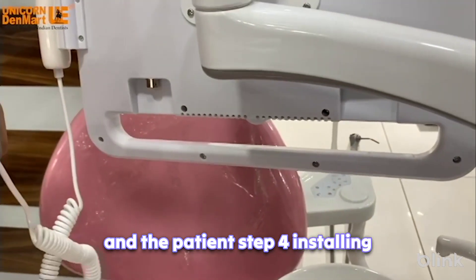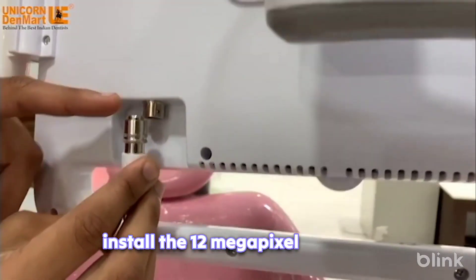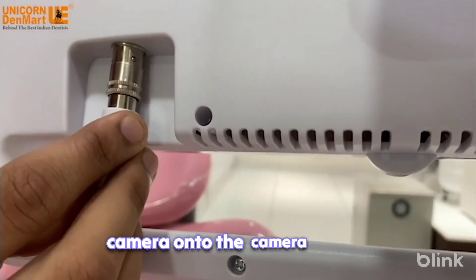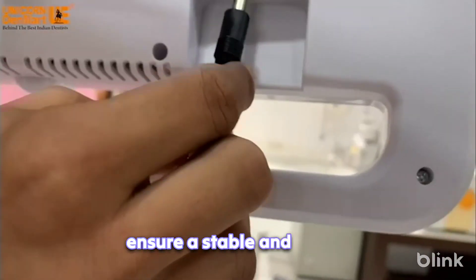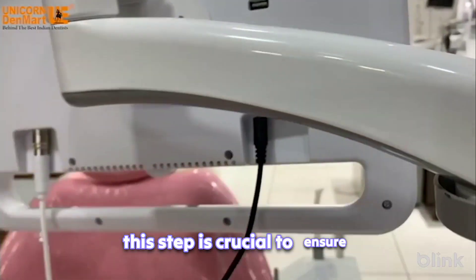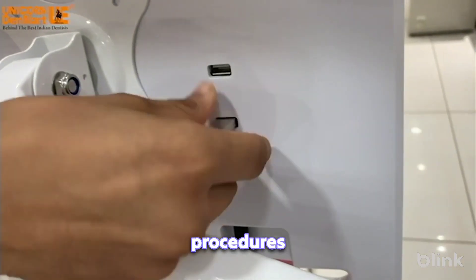Step 4: Installing the camera. Install the 12-megapixel Sony CCD camera onto the camera holder. Use the camera clamp fixer to ensure a stable and secure attachment. This step is crucial to ensure accurate imaging during dental procedures.